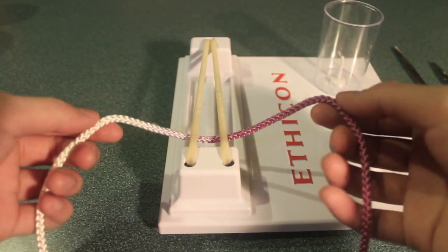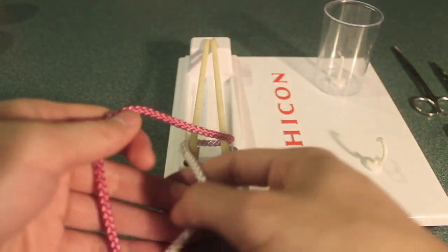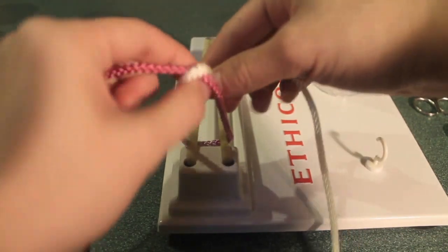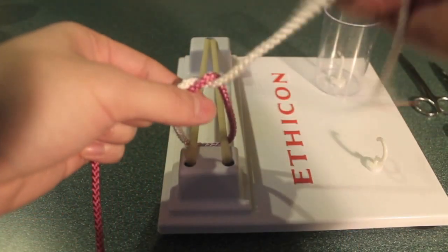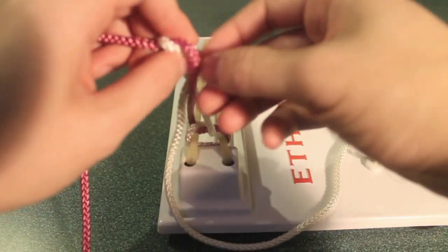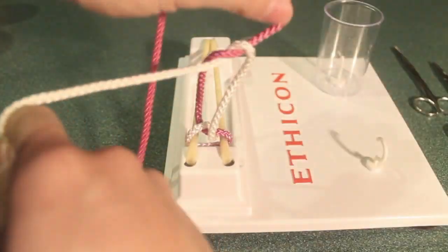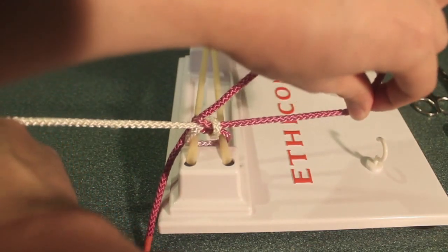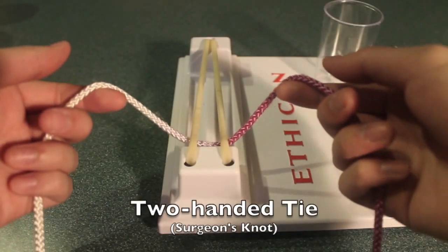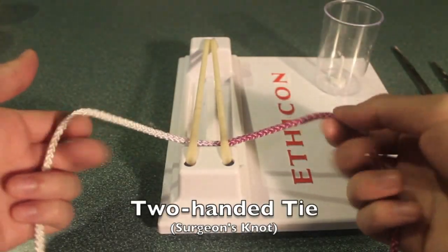Let's repeat the same thing but in real time. Now let's make a surgeon's knot with a two-handed tie.